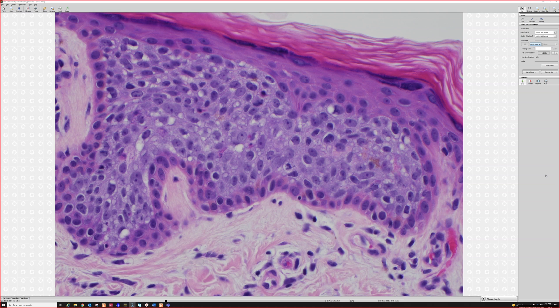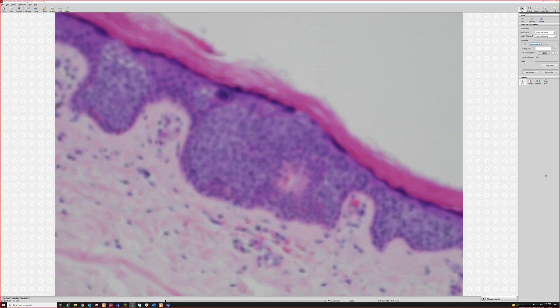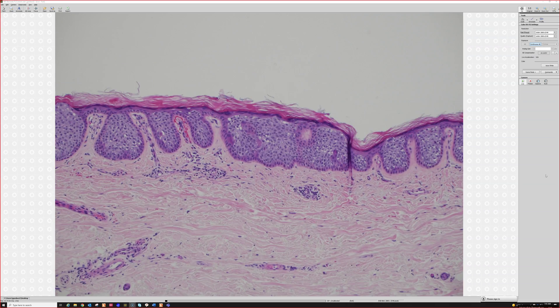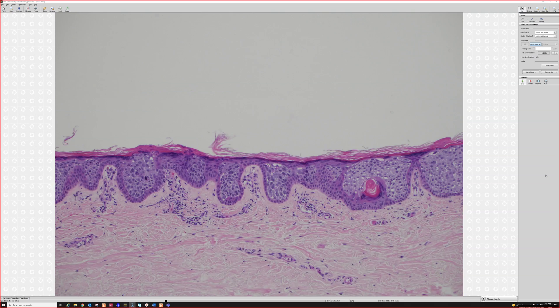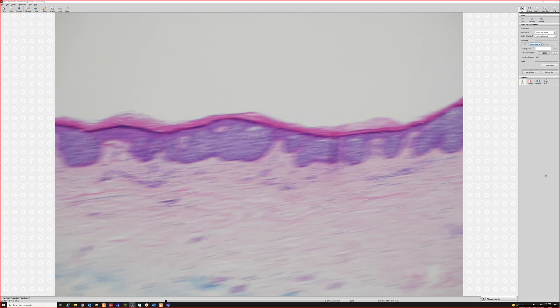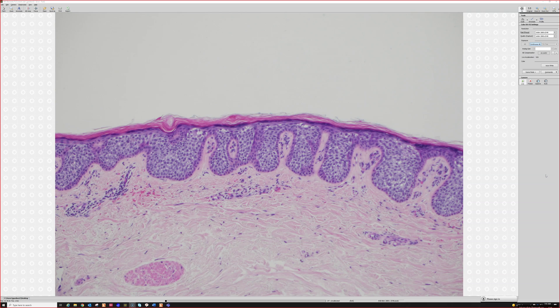That's a pretty useful sign for squamous cell carcinoma in situ. You can see a little bit of eyeliner sign in Paget's disease, although it tends to be thinner and more compressed. You do not usually see it in melanoma in situ. So this is an example of the clonal or pagetoid form of Bowen's-type squamous cell carcinoma in situ. These are also reportedly diffusely p16 positive — I learned that from a colleague on Twitter, though I've never done that staining myself. That's an interesting finding — look at that, it's unbelievable.